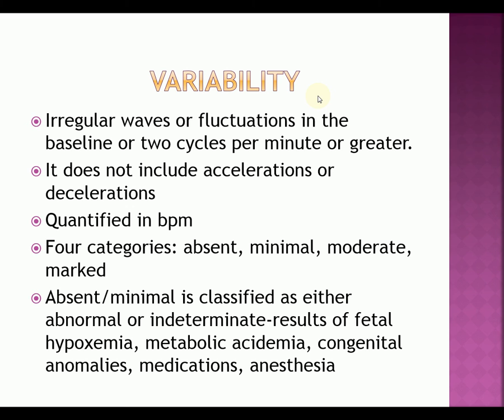And there are actually 4 categories. And the 4 categories are absent, minimum, moderate, and marked. And there are some things that are actually going to affect those. Now, one thing I want you to be sure to look at on figure 1817 on page 418, it's showing you the difference in the categories.